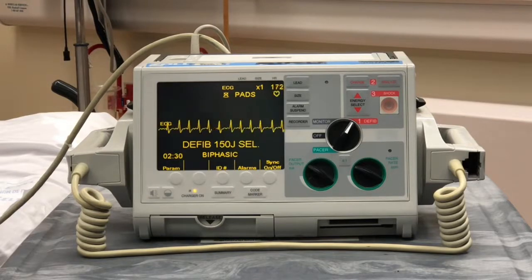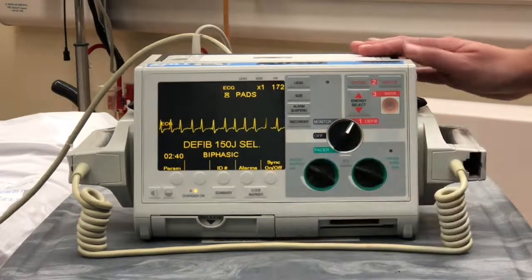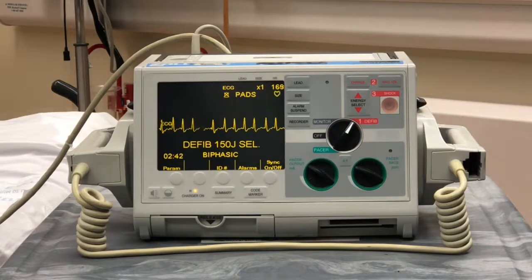You note that the defibrillator is going to default back to defib and unsynchronized for safety. It's important to make sure every single time you're doing a cardioversion, you are pressing the sync button.